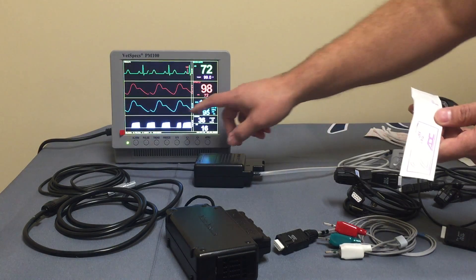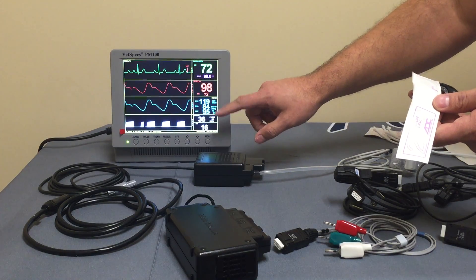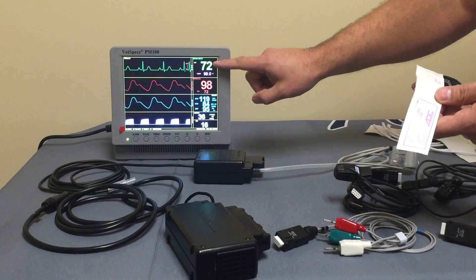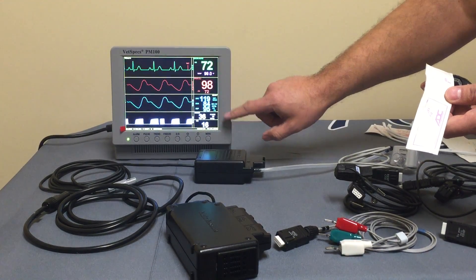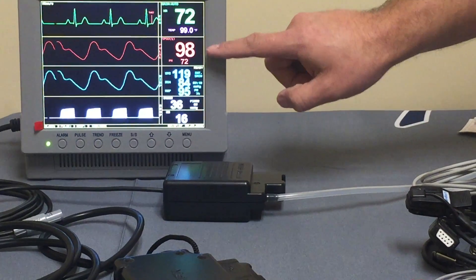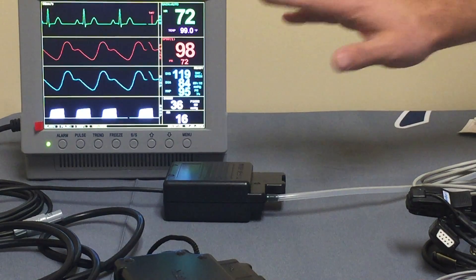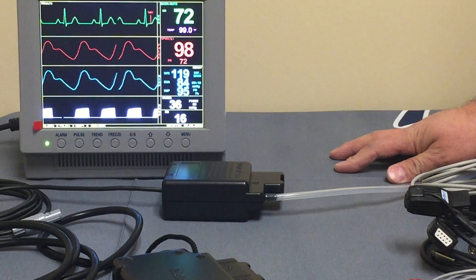Getting a waveform real-time is a very nice technology — a bit of a hybrid compared to other systems out there. The system gives you systolic, diastolic, and mean arterial pressures. You have a heart rate from your ECG, a peripheral pulse from your SpO2, and an additional peripheral pulse from the blood pressure source in the lower right. Being able to see matching pulse rates from different monitoring parameters gives you confidence that the monitor is monitoring properly.